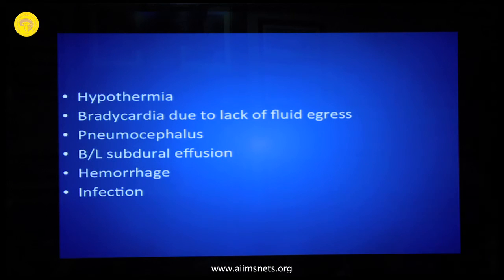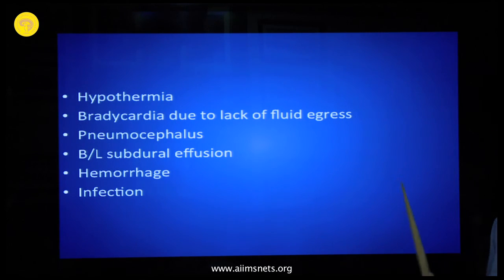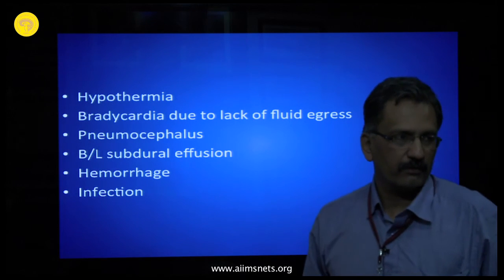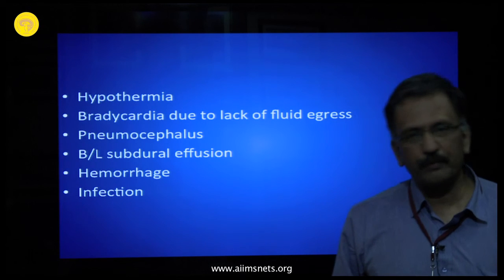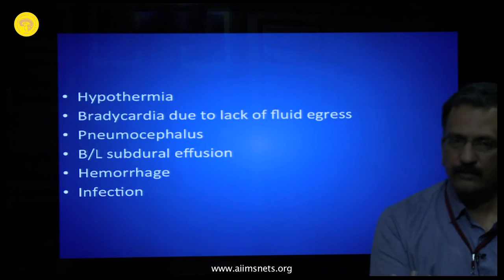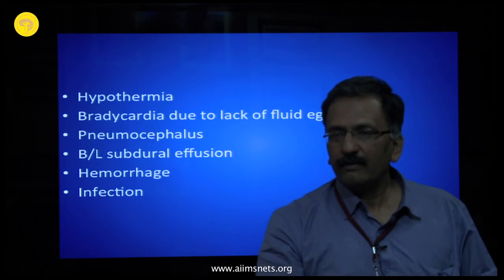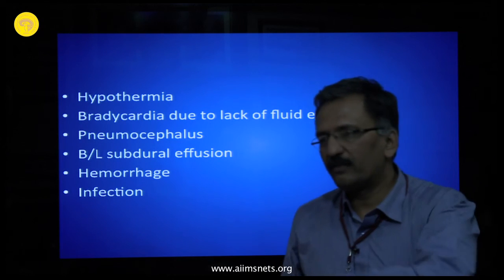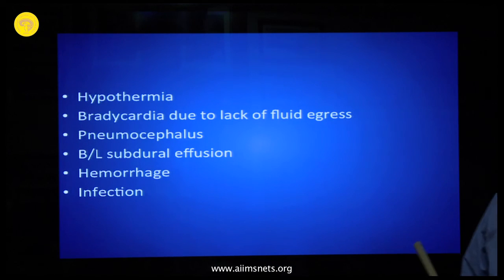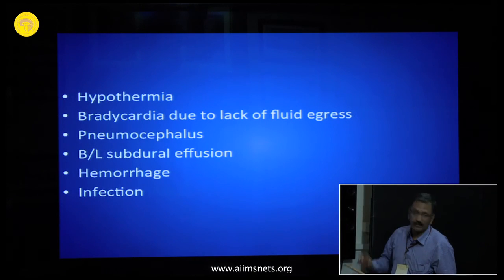That's very important. Now, if you get dilated ventricles with bilateral subdural effusion, that's a very tricky situation. I think your third ventriculostomy may not be working, because the entire CSF is coming out through the port that you went through and is accumulating outside. If there is progressive hydrocephalus, you must plan a ventriculoperitoneal shunt or maybe repeat the third ventriculostomy. This is something you really need to look at.